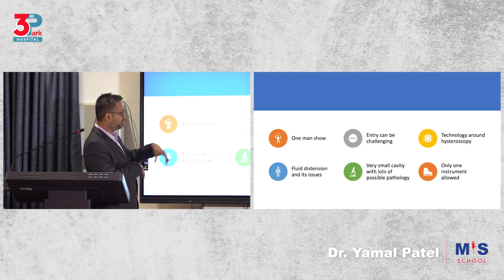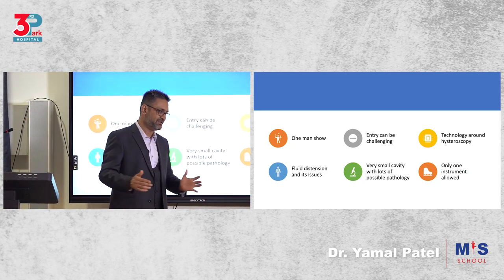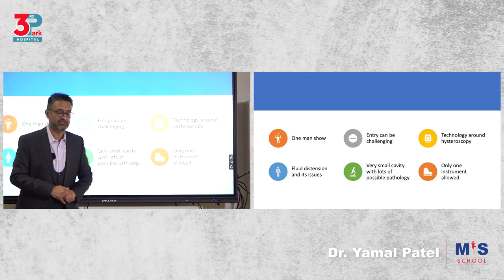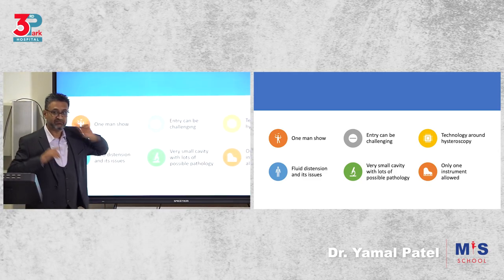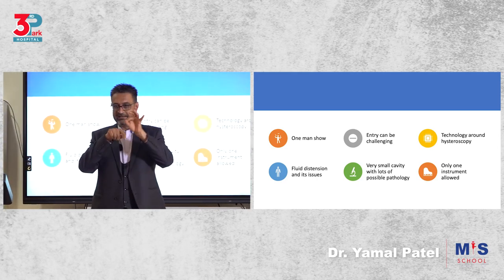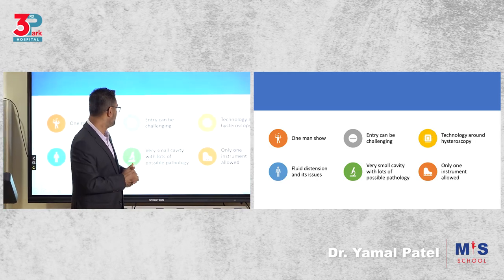Remember, it's a one-man show. The most challenging part is the entry. If you do your entry properly, the rest is okay. This is where people get stuck. You need to know the technology around hysteroscopy. Ideally speaking, this should be taught vaginoscopic. I only do vaginoscopic. I never hold, dilate, and go in with a hysteroscope. Go in direct with the vaginoscopic entry.